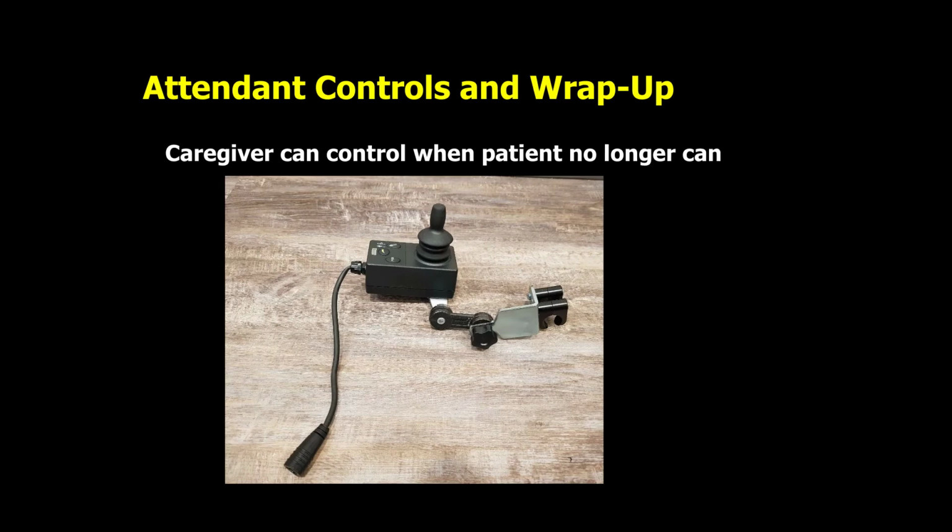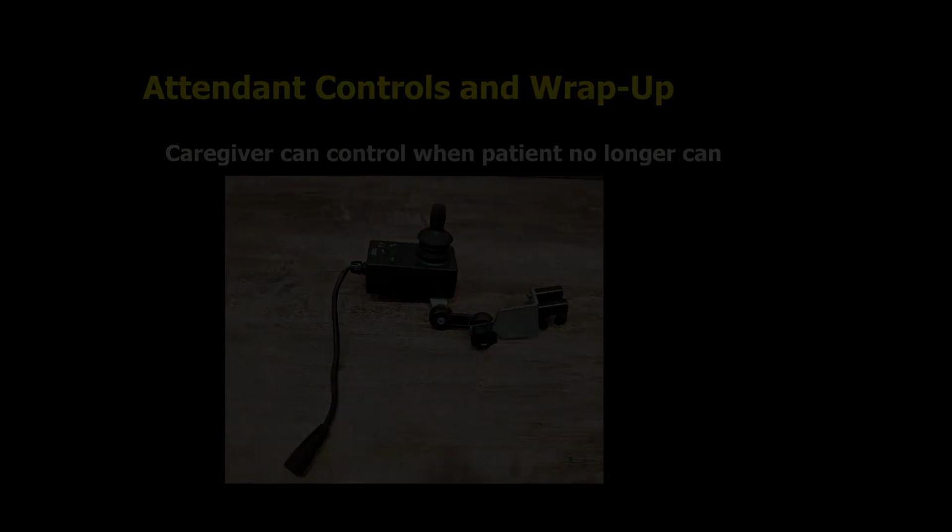Again, this wheelchair was recommended by the kinesiologist at the VA that I see. That is the only reason that I have this version. We might not have had half of these controls if she hadn't recommended it.